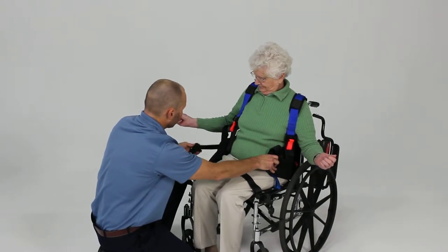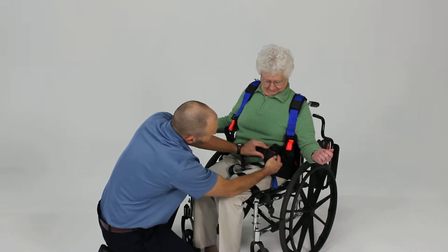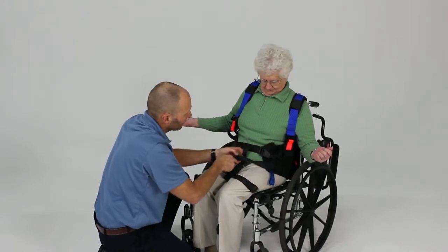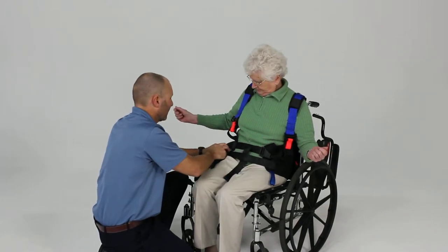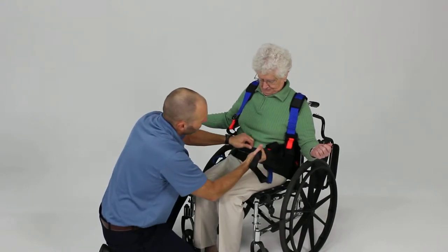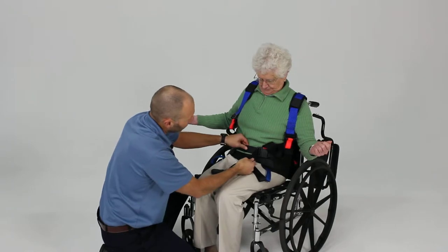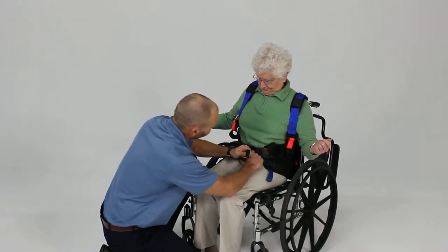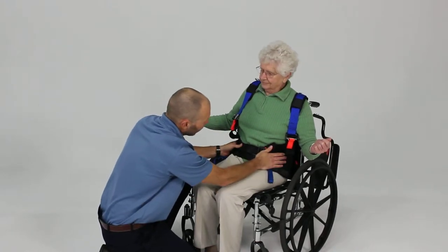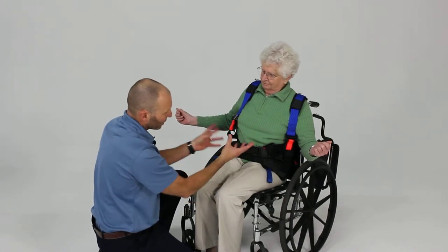Go ahead and clip the front buckles in place — the top one first, then the bottom buckle on the opposite side. We want to get these as tight as we can by holding onto the webbing and feeding it in as you pull directly across, which gives you the best angle of pull. Make it as tight as you can comfortably in the sitting position, because as they stand up it's going to loosen up a little bit.